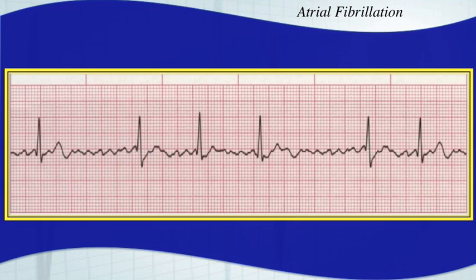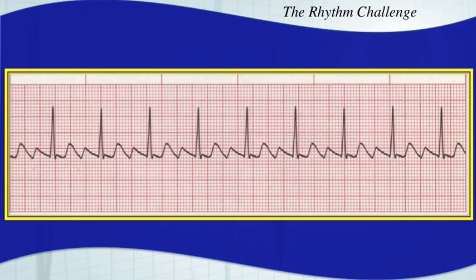This is atrial fibrillation. Get ready to hit that pause. Here's your next one — now you have atrial flutter with 3-to-1 conduction. Flutter waves continue throughout. There's one really hidden in that QRS complex. Three-to-one conduction.